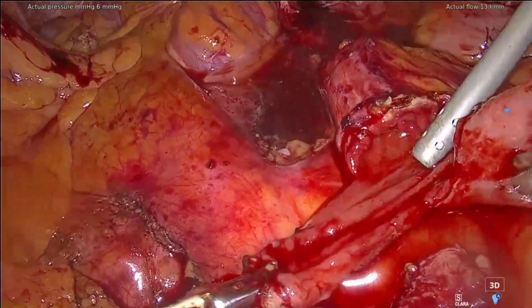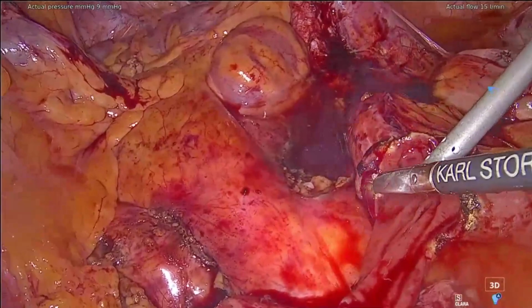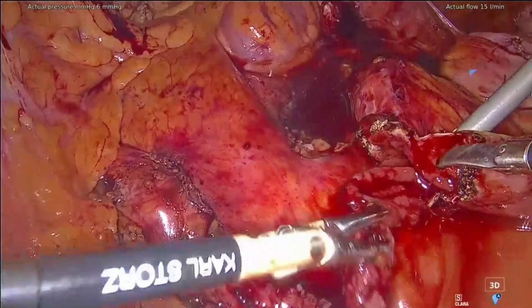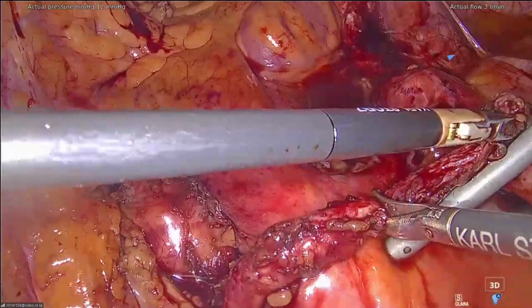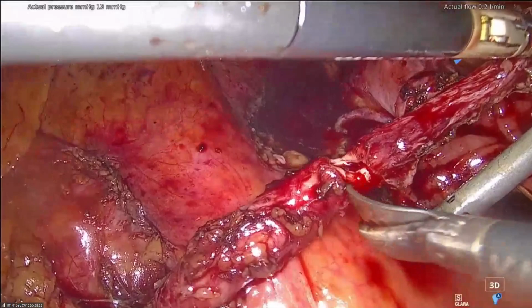Not too much, because I don't want to have a stenosis of the bladder itself. You see that I save a significant length. Yes. No, release. And now when I have my ureter, yes, it's nice. Well, I cut here. Camera inside. Yeah, I have blood, and you see that? It bleeds, and I'm sure that this side is well vascularized.